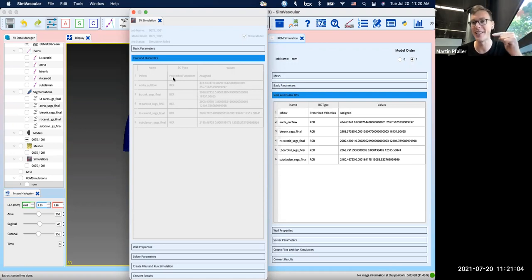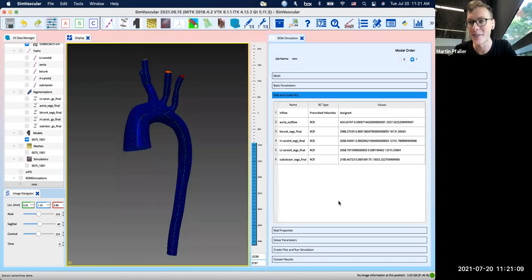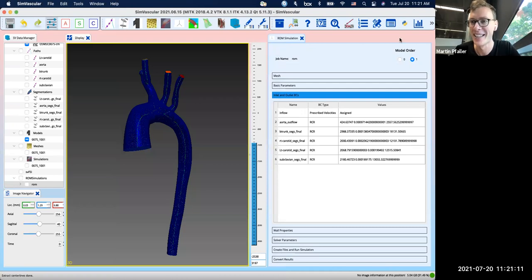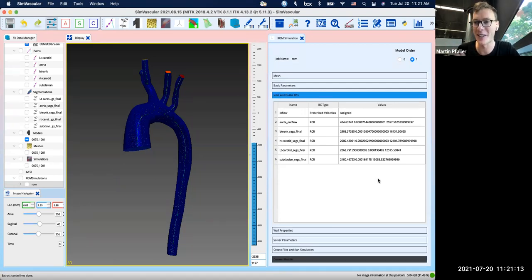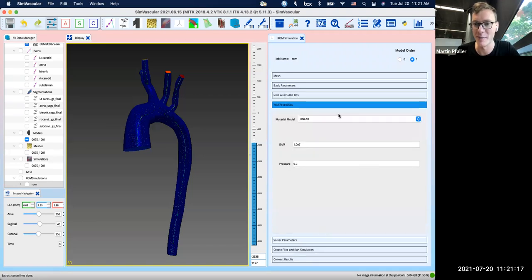One thing to note also is in the 3D model we define inflow as negative, and for 1D and 0D models we define inflow as positive. So that's maybe something we should change in the future, but right now keep that in mind that the convention is different.